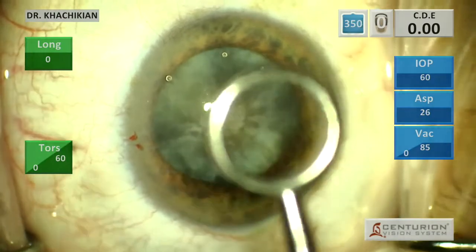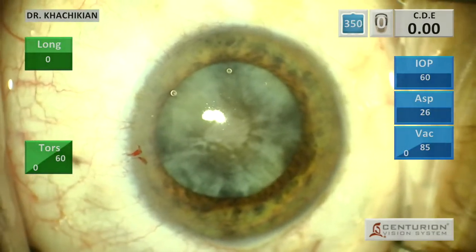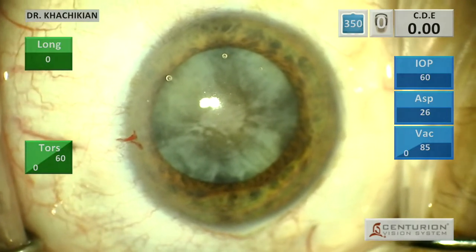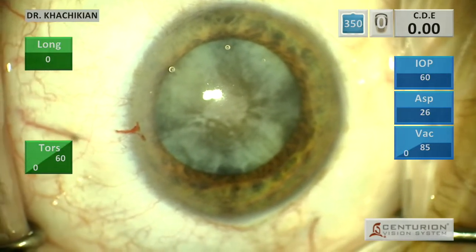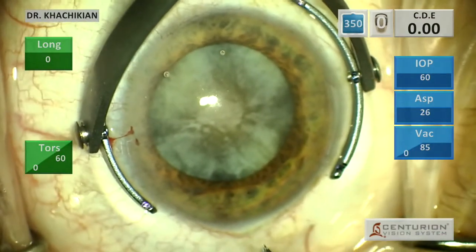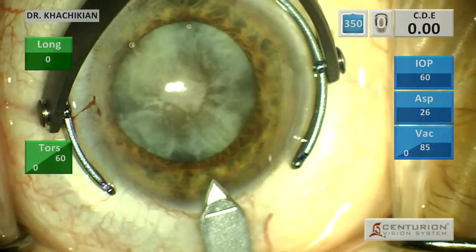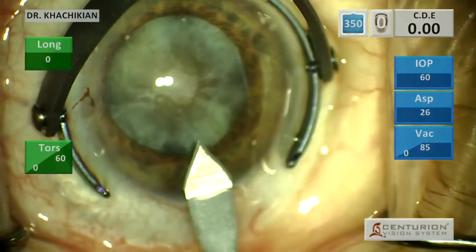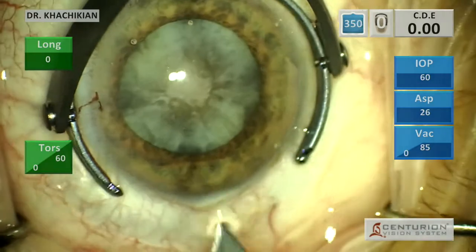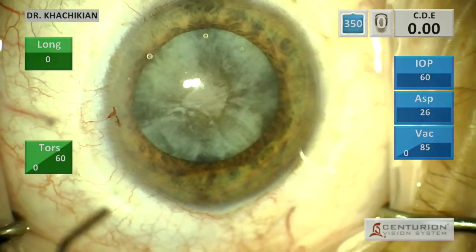Good afternoon everybody. This is Dr. Kachikian with the Black Hills Regional Eye Institute, and here we have a case of a very dense cataract. This is a very advanced cataract, kind of amber, fibrotic nucleus, and on exam you can tell that even the anterior capsule has contracted and become very fibrotic.